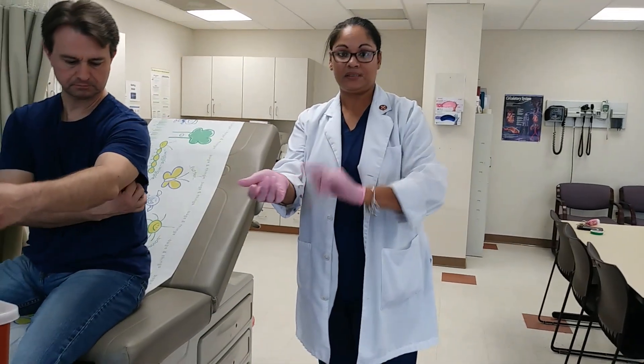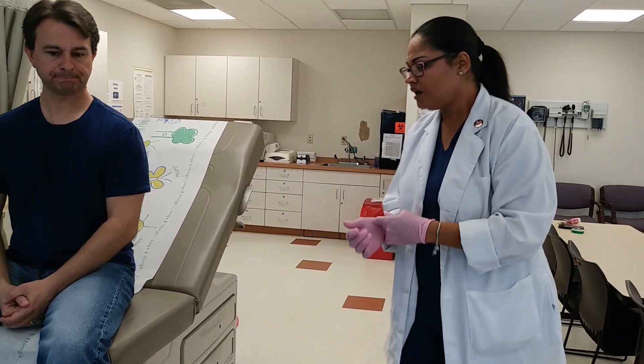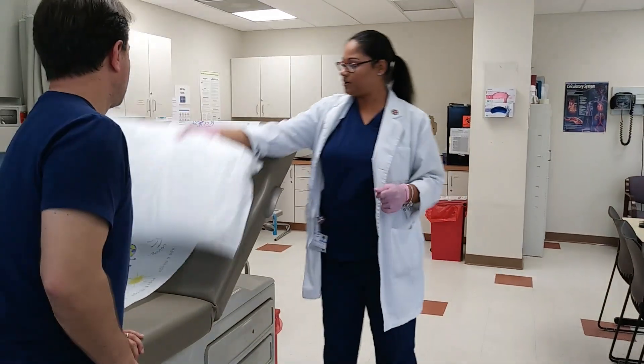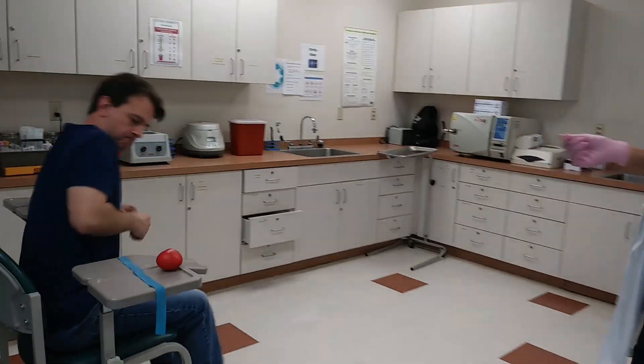The next injection we have is the intradermal injection, which is the TB skin test. At the end, I'm not only walking you through it, but I'm also going to give you the instructions that you give a patient. If you don't mind, I'm going to ask that you sit in the venipuncture chair. I'd like for you to be able to relax the arm and have somewhere to put it.